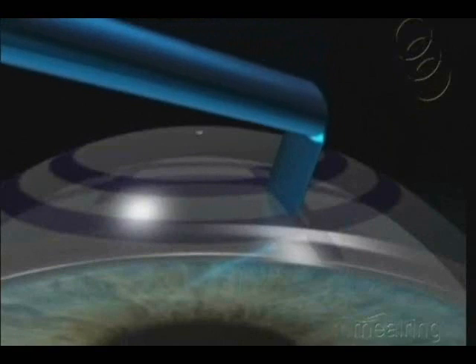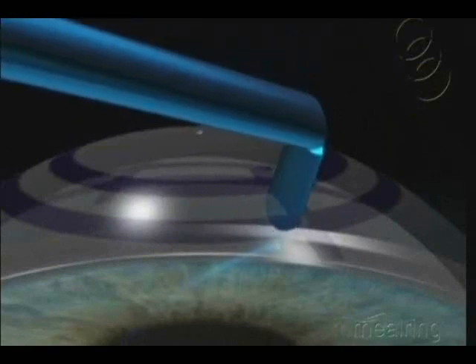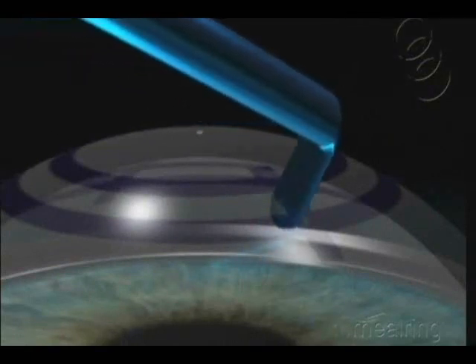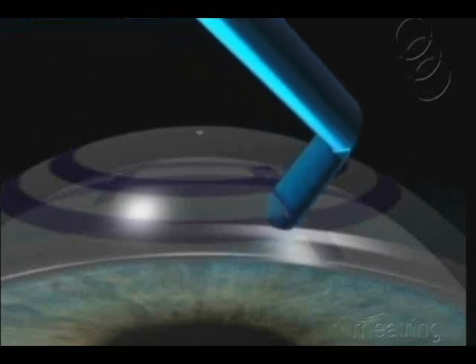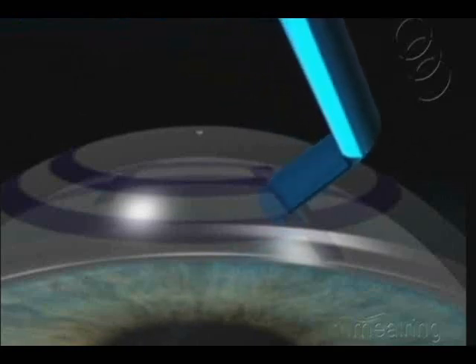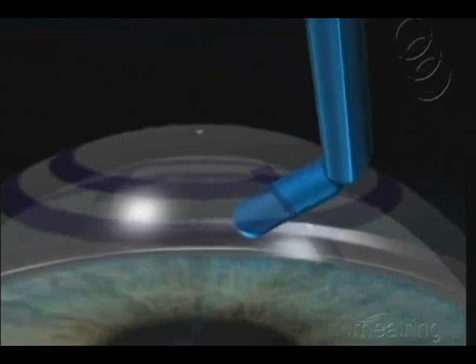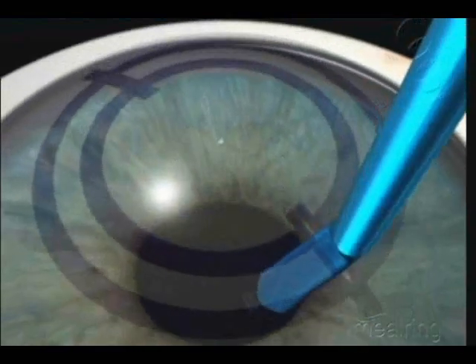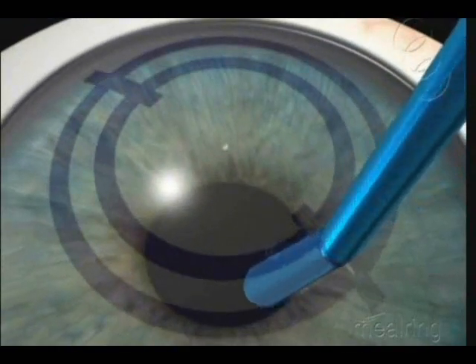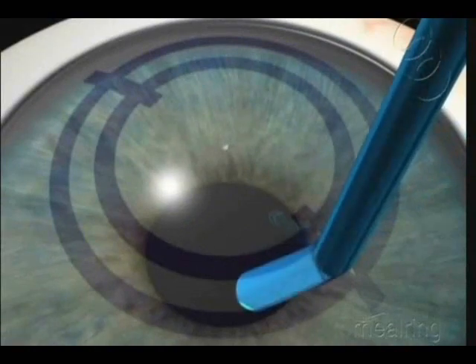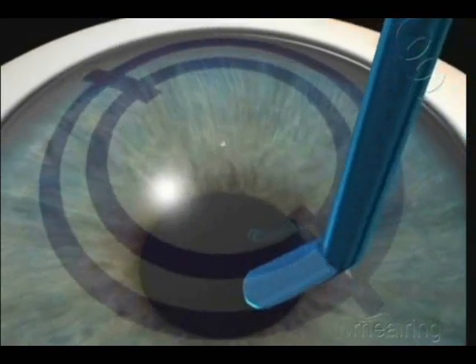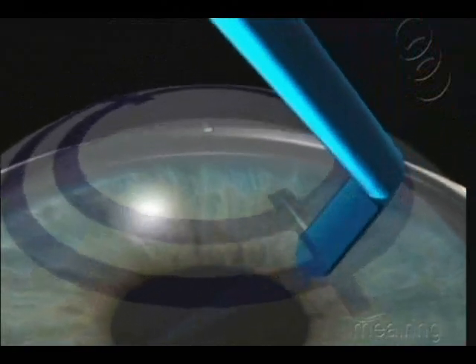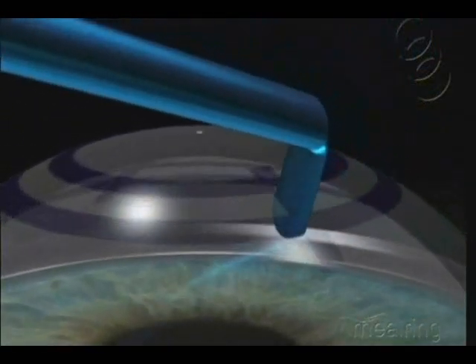Insert the tip of the Suarez spreader. Introduce the tip vertically into the incision, then change the inclination to horizontal to enlarge the pocket created in the previous step. Rotatory movements help its progression. It is very important to keep the correct pocket depth.